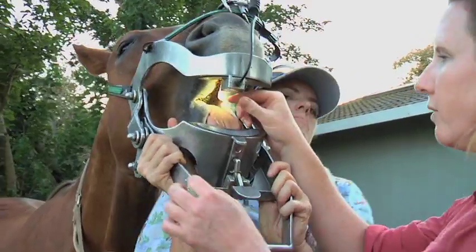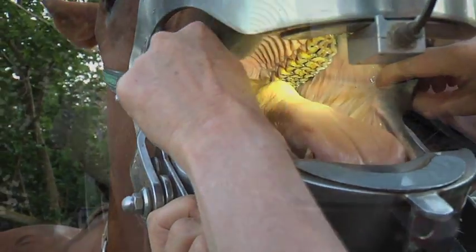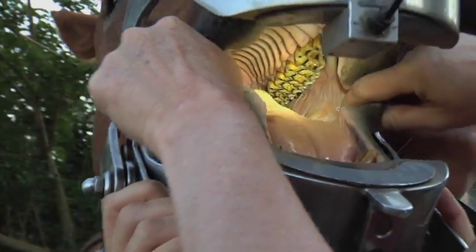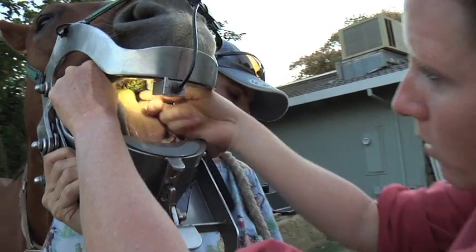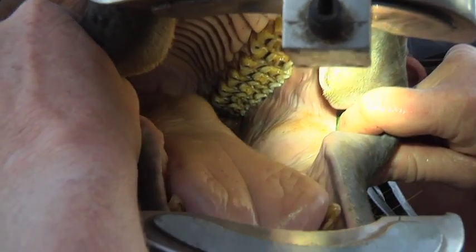This allows us to check for any points, any hooks, or anything that may interfere with the normal bite of the horse. Scooter's mouth was actually floated not long ago — he doesn't really have a lot of abnormalities. He has some minor points, but they're not very sharp yet, along both the outside buccal surface on the upper arcade and along the inside lingual surface near the tongue. He has a little mild unevenness of the table surface of the teeth. For a 15-year-old horse, his teeth actually look pretty good.